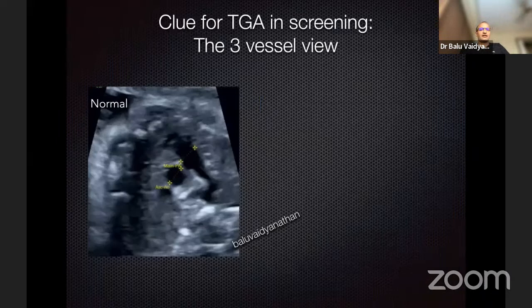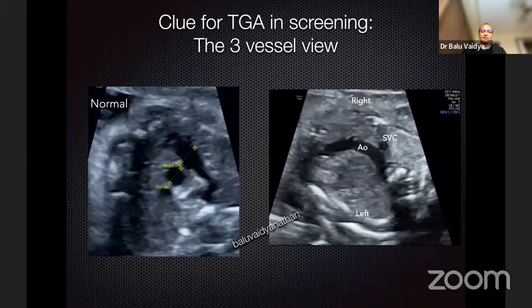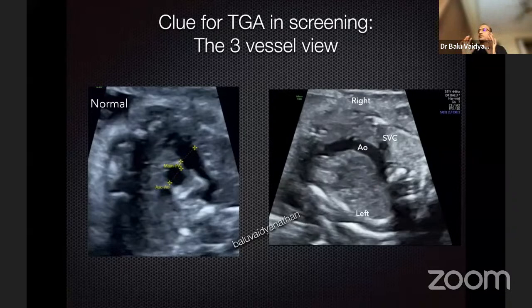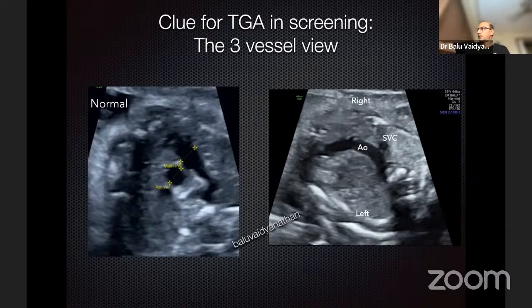Three clues. The most important: normally you find three vessels in the three vessel view, but in this lesion you find only two vessels — only the aorta and the SVC. The reason is that the PA has already come as a posterior vessel and is not visualized in the three vessel view. This particular view — seeing only two vessels — is actually the view you get in TGA during screening. Whenever you get this picture, one of the important conditions you should suspect is TGA, and you should go back to the outflow and other views to confirm how the great arteries are related.